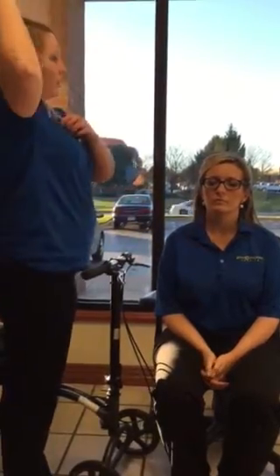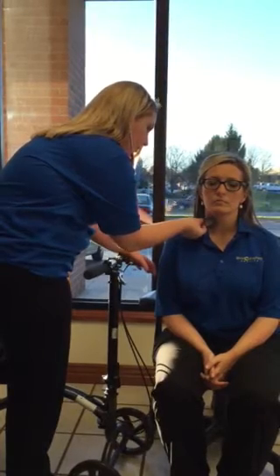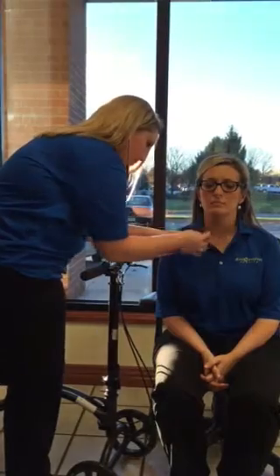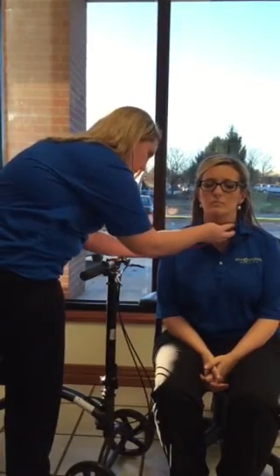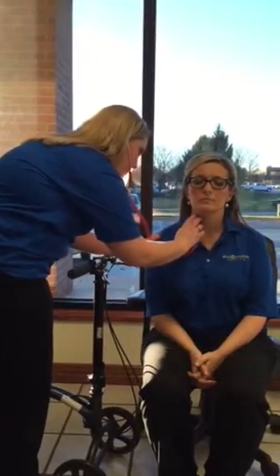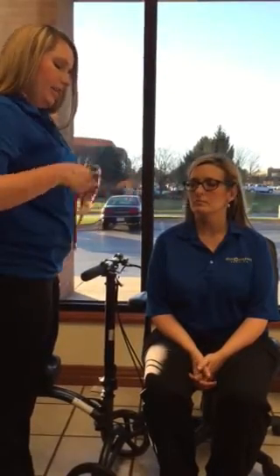Next I'm going to listen to it, and I'm going to listen with the diaphragm and the bell part. Okay, so I was listening for any murmurs, anything like that, any abnormalities.